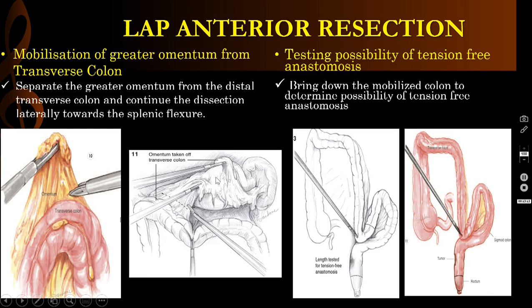Sorry, I have told that we have to remove the greater omentum. We need not, because this is not colon cancer, this is rectal cancer. So we need not remove the greater omentum.